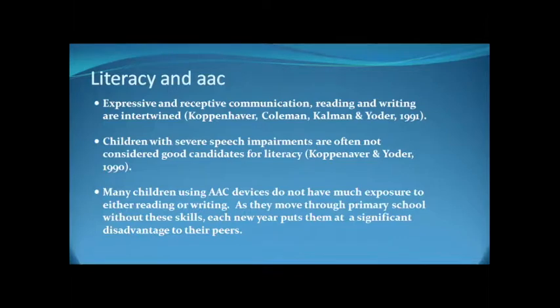So, a few facts about literacy and AAC. Back in the 90s even, they were doing some research on this and finding that expressive and receptive communication and reading and writing all are mixed together. They all sort of help form it together. So children with severe speech impairments are often not considered good candidates for literacy. And that's what they were seeing in the field in 1990. It didn't mean that they really weren't, it just meant that they weren't seen like that.